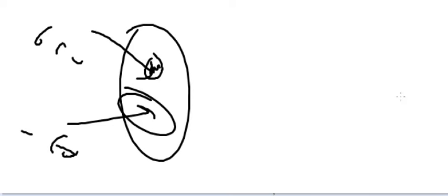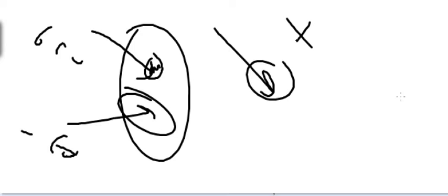What if I put the cursor on something and it shows me, for example, plus 3000? We said the bone is 1000, not 2000 or 3000. What does that mean? It means a metal, not only calcification, something very dense like a bullet, plate, or screw, something metallic that is denser than calcification. Theoretically we teach from minus 1000 to positive 1000, but any CT scan will show you 2000, 3000 Hounsfield unit easily, and the computer can measure these densities. Not that difficult.